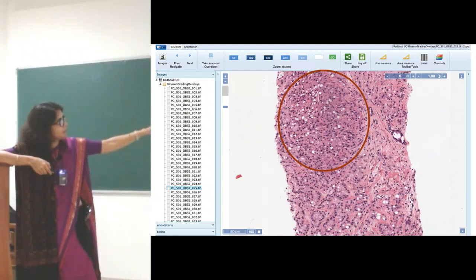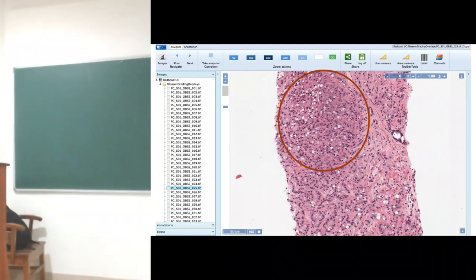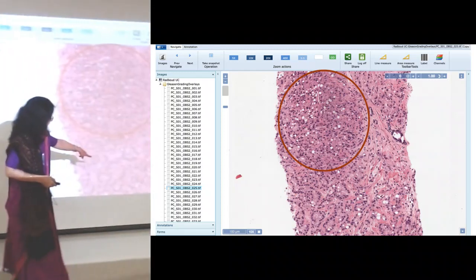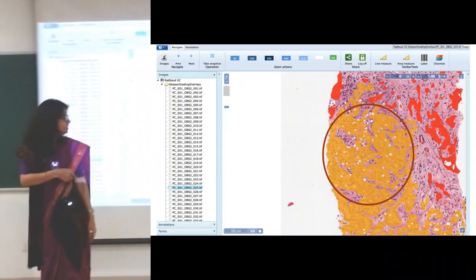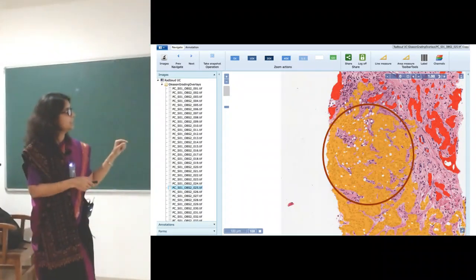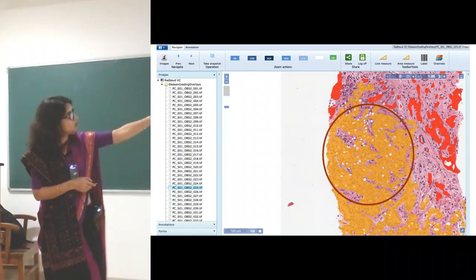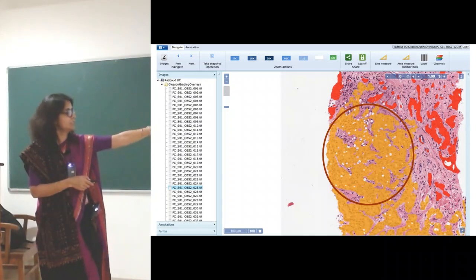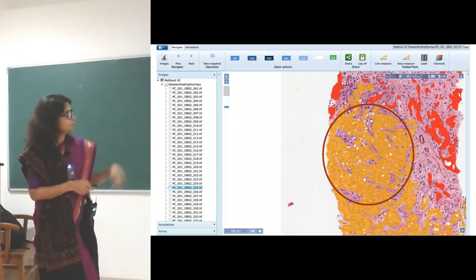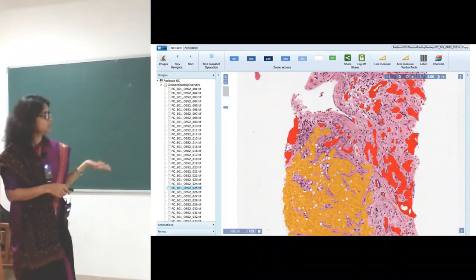The circled part is more in sheets, like that in the corner. This part is more similar to that corner area, which is pattern 5, and this area is pattern 4. The computer unfortunately wrongly identified the large 5 part as also pattern 4, but the small area of 5 it picked up correctly. So AI is good, but it wasn't 100%.